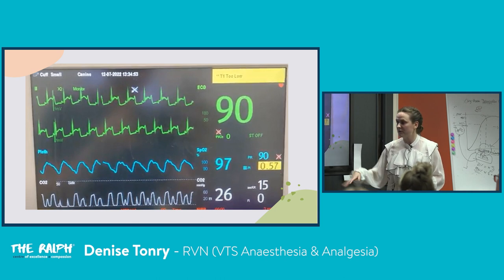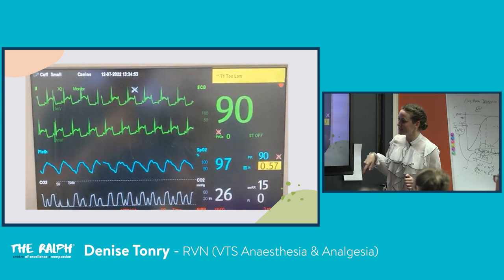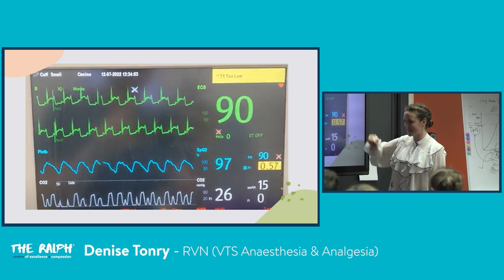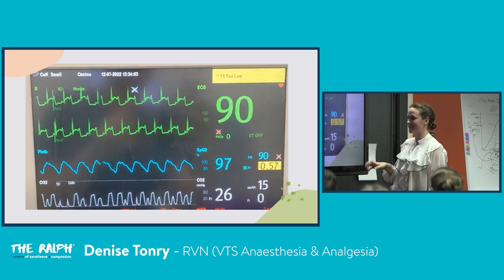So this is, for example, a chaotic capnograph. To be honest, I just found all these on my phone, so I don't know. This patient, I would ventilate. I would just have no tolerance for whatever this panting is. This is your huffy white dog, classic, and you're trying to give propofol just to stop it.